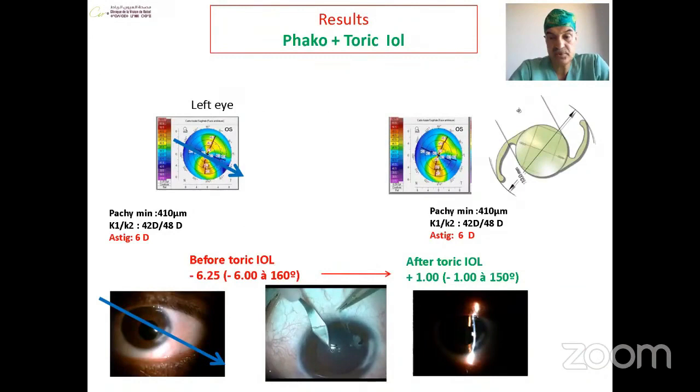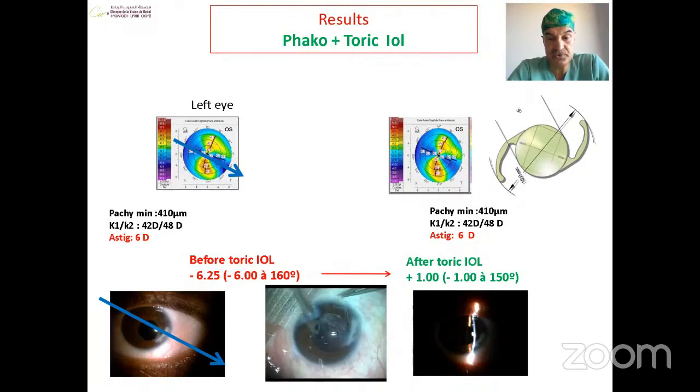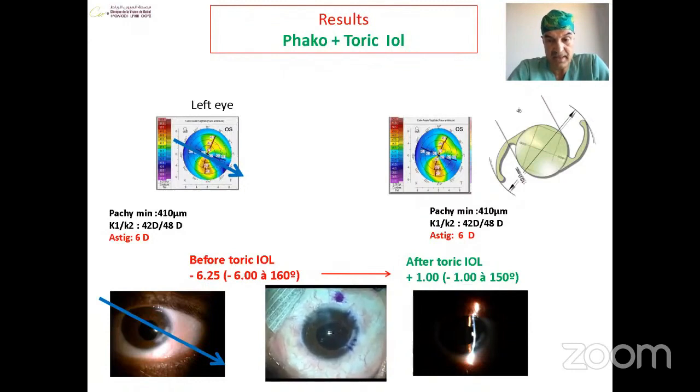We opted for phaco with toric IOL because even though the astigmatism is irregular and caused by scar and trauma, it has a regular dominant component, and the capsular bag is good apart from a little fibrosis near the wound, with a normal posterior segment.